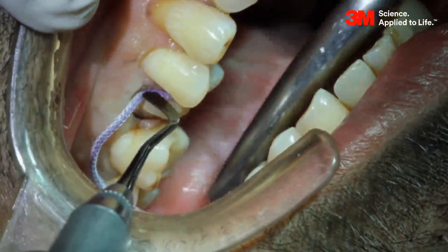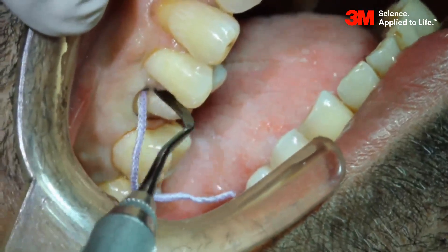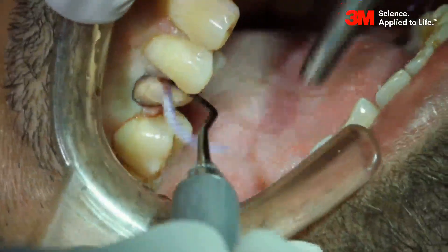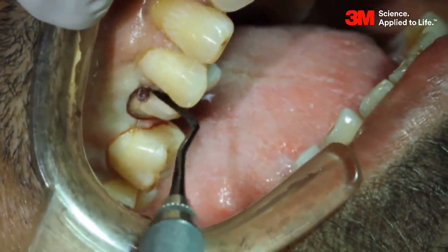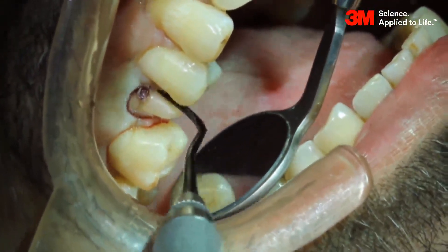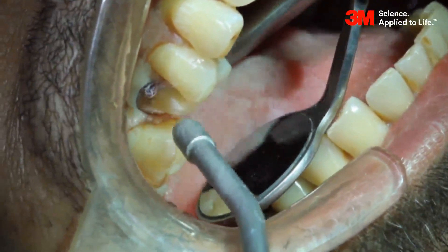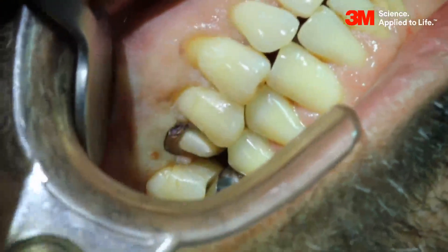Retract the gingiva completely so that when we are doing the impressioning technique, all the margins are seen clearly. Maintain the isolation. Use a 3-way syringe and suction tip. Tell the patient to bite to check the occlusion.